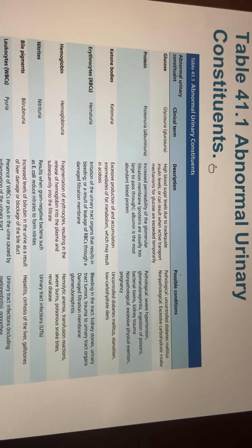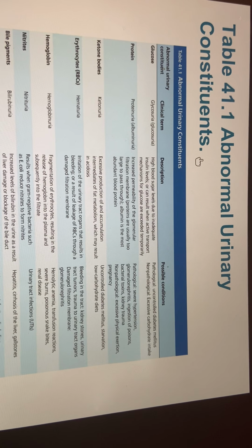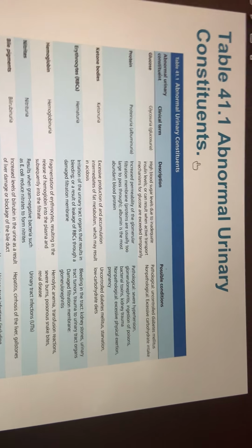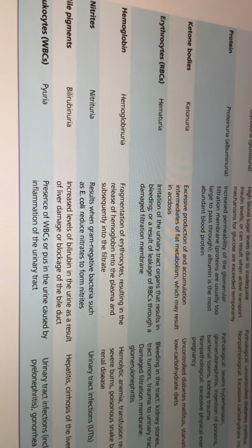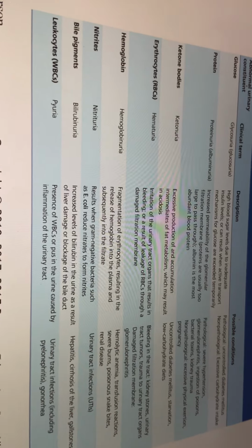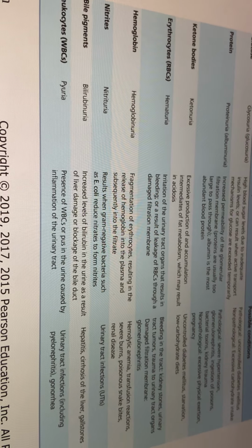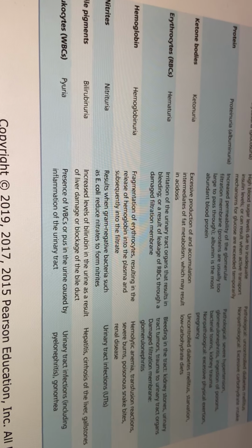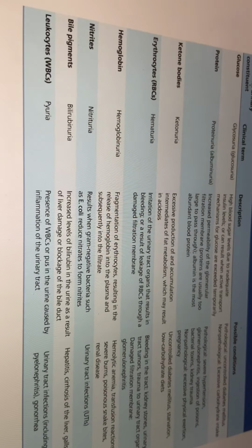And then pathologic number two is hepatitis, okay? Write that down. Instead of unknown, I'm giving it to you already. So instead of unknown, you put number one, pathologic number one is diabetes mellitus urine. Pathologic number two is hepatitis urine, okay? Urine of a hepatitis patient.